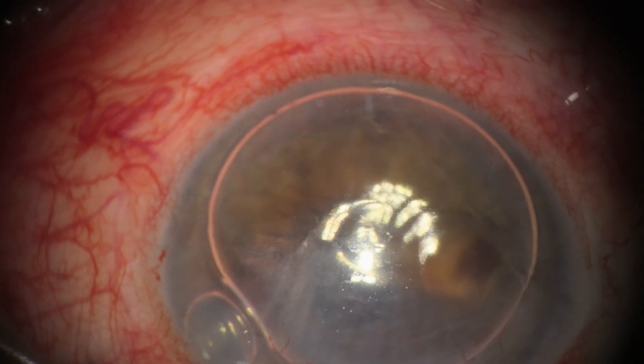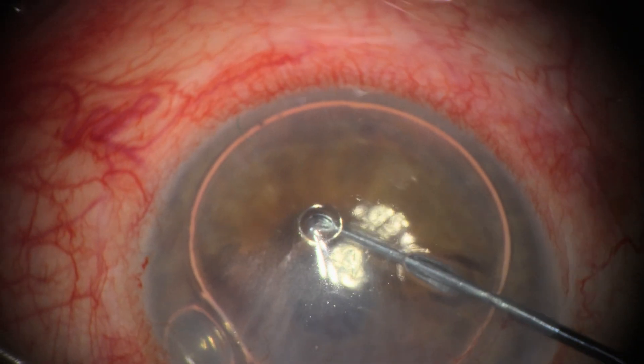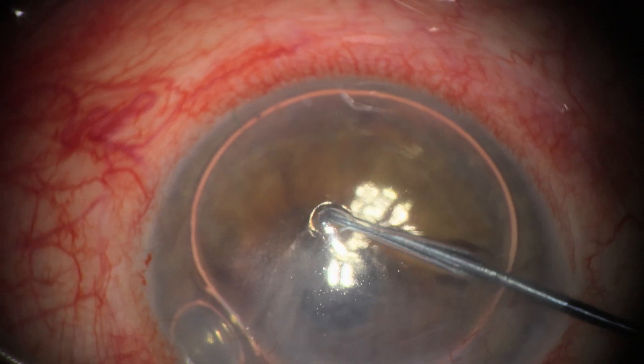Eight months after the conversion, a thick wad of tissue progressed as a retrocorneal membrane with vascularization.